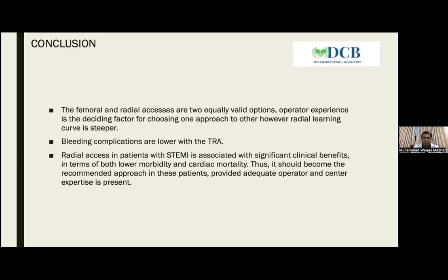Now in many centers for TAVI, for example, there are two contemporary approaches with a wire protection put from the left. For example, if you have the right femoral approach as the main approach, you can put a wire from the left to protect it, and in case you have a complication, you inflate a balloon very fast and you can work easily on the complication.